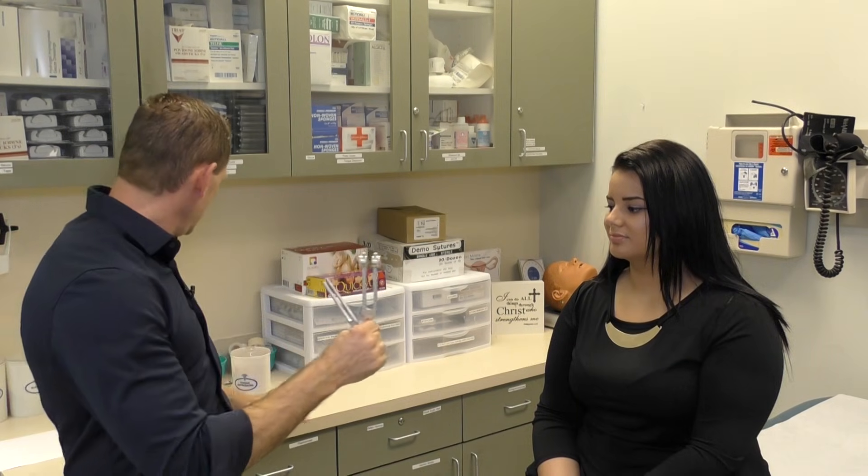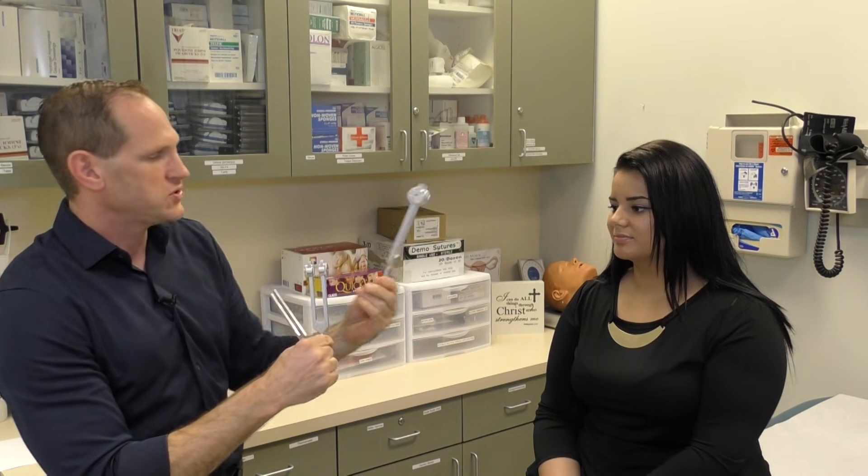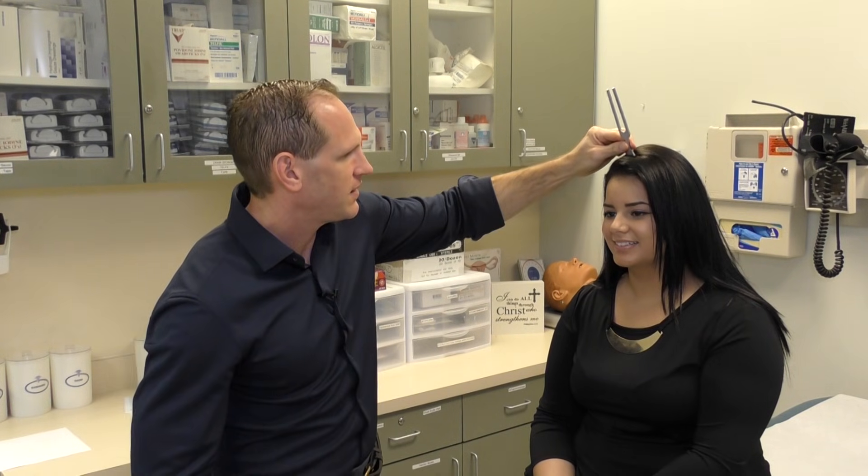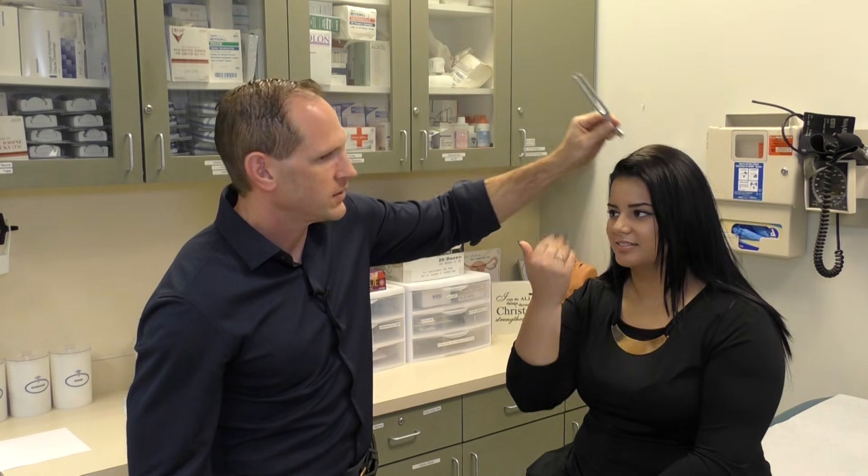The next step is the Weber test, for which you need a tuning fork. This one is a 512 Hz, and we also have 256 and 128. For these tests you ideally want to use a 512. Tap the tuning fork and place it firmly on the patient's head. You're looking for them to hear it above their head or equally in both ears. If they're unsure where they hear it, that's usually a good sign. If they clearly hear it on one side only, that's an abnormal or positive Weber test.